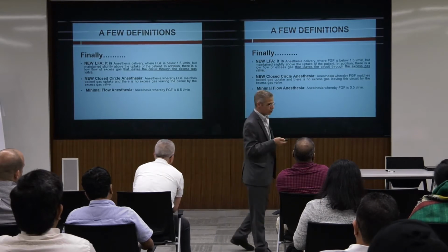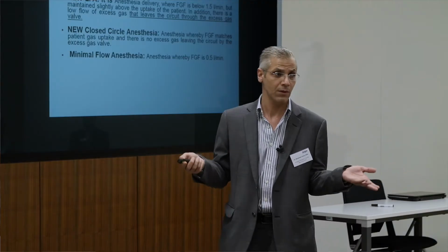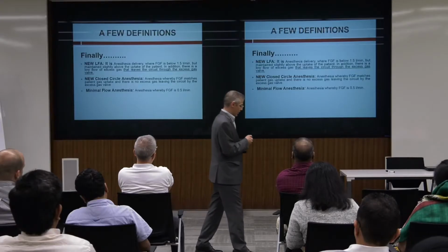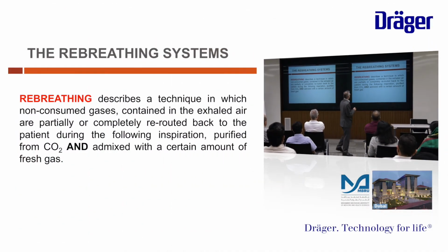And during our talk, we will discover that there is something called metabolic low flow, metabolic fresh gas flow, which reaches around 0.3 liter per minute. Rebreathing describes a technique in which non-consumable gas is rerouted in the circulation.